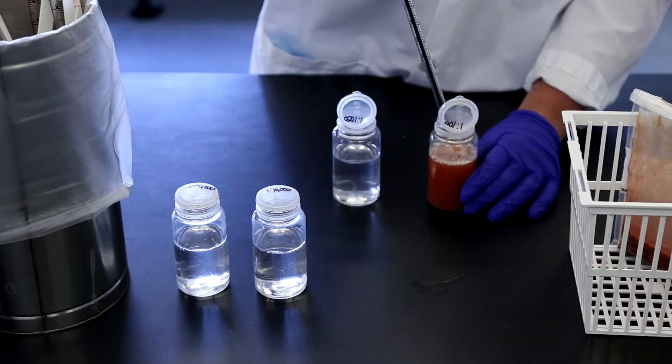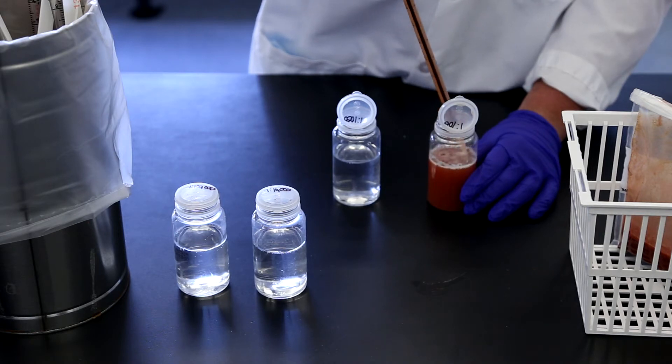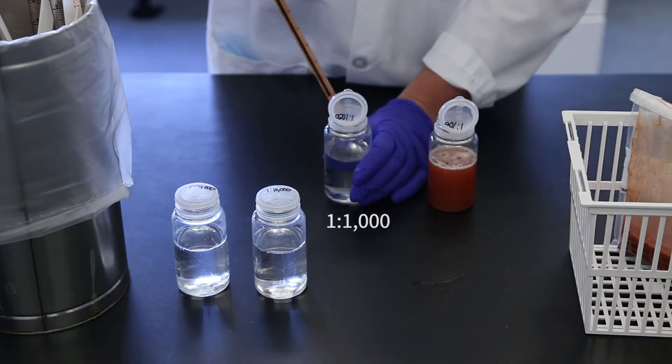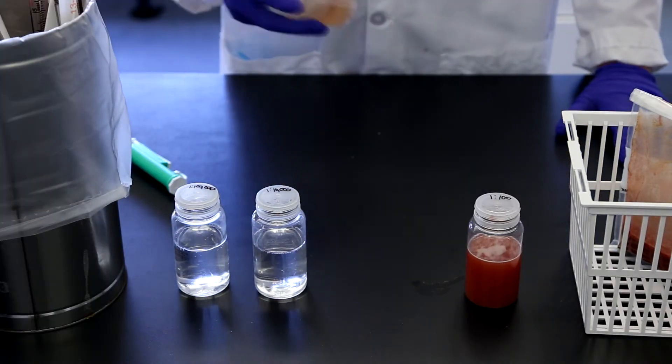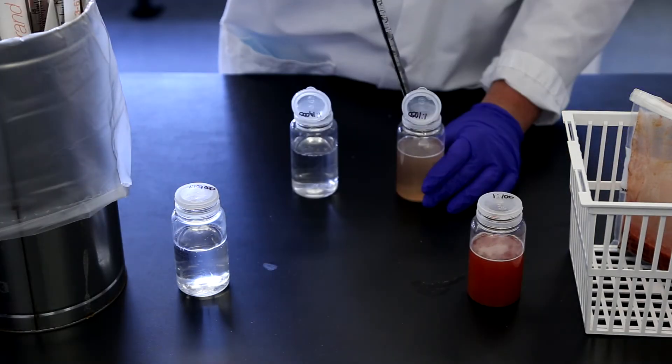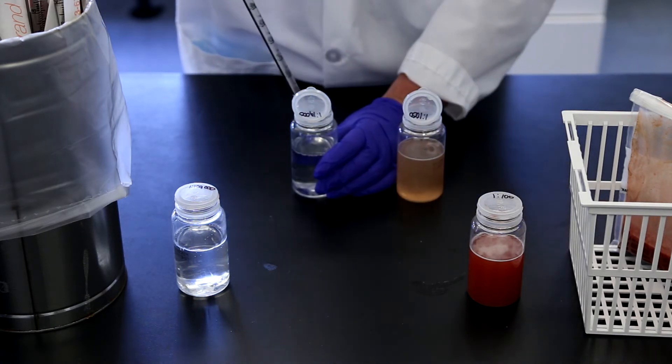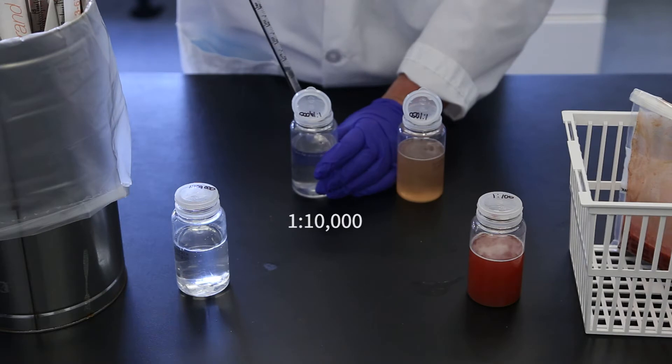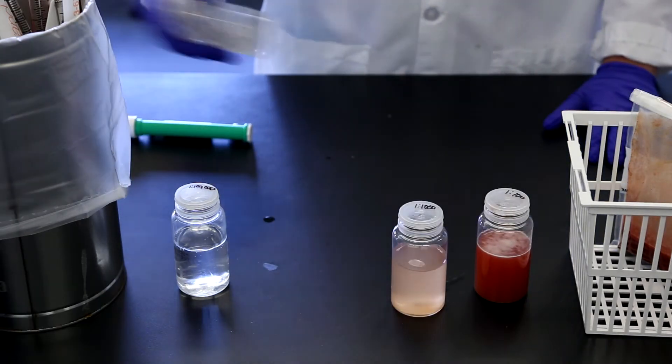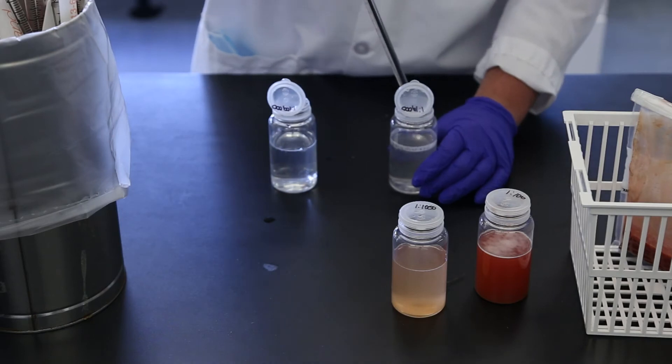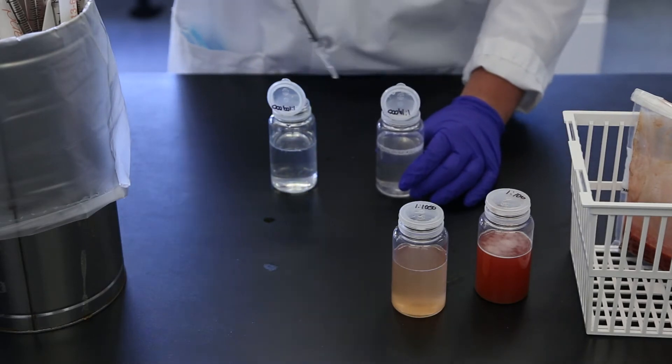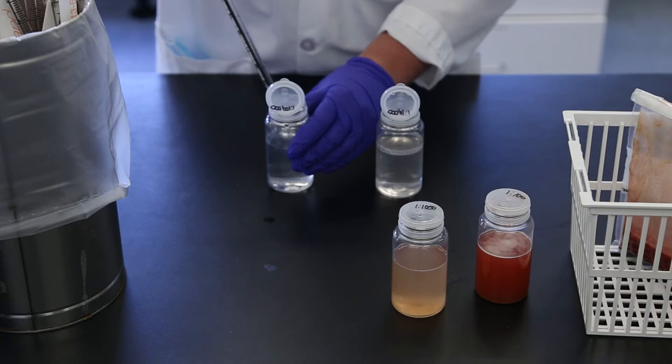For less than 1,000 CFU per gram, transfer 11 milliliters of 1 to 100 sample into 99 milliliters of buffer. For less than 10,000 CFU per gram, transfer 11 milliliters of 1 to 1,000 sample into 99 milliliters of buffer. For less than 100,000 CFU per gram, transfer 11 milliliters of 1 to 10,000 sample into 99 milliliters of buffer.